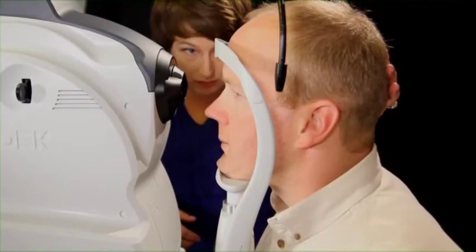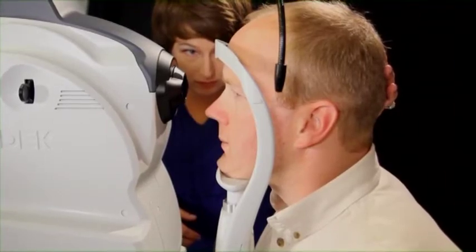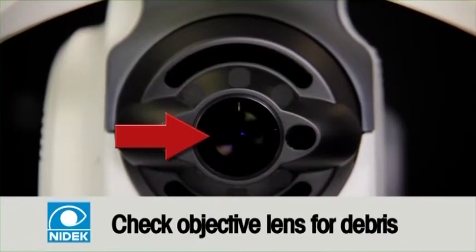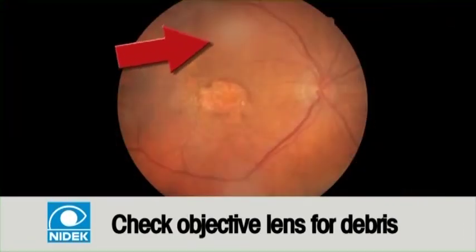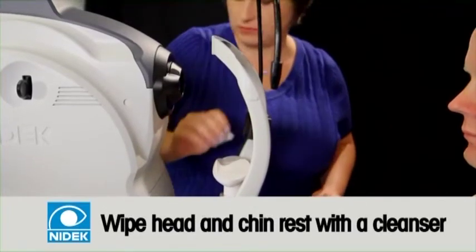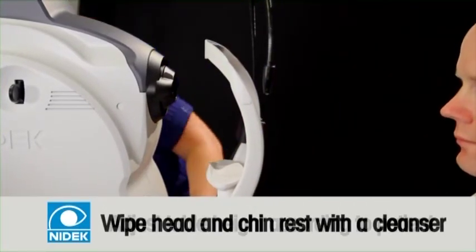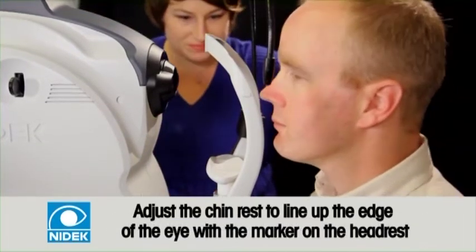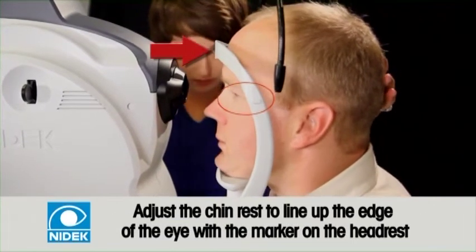It is important to have the patient lined up properly before starting to take the image. First, check the objective lens for any debris. If the lens is dirty, you will have a smudge that will appear in all of your images. Secondly, wipe the head and chin rest with the cleanser. Adjust the table height according to the patient. Have the patient place their chin in the rest and forehead pressed firmly against the band.